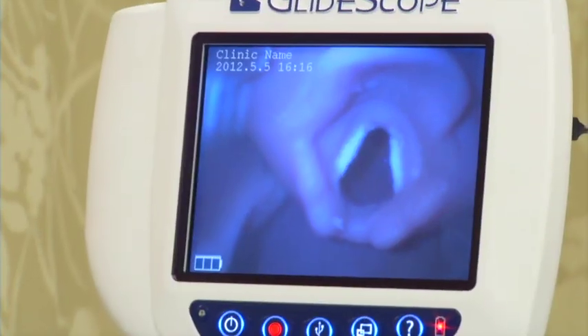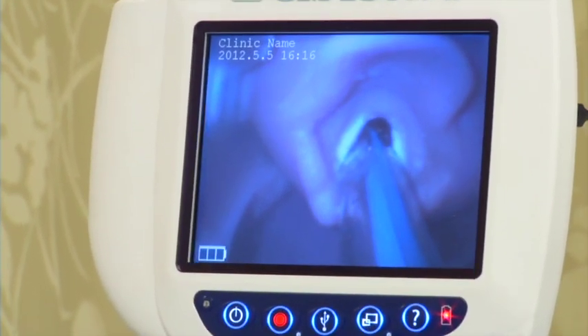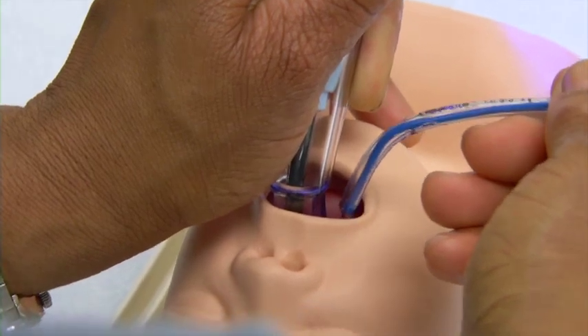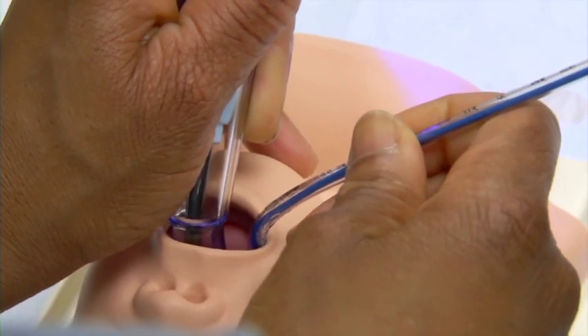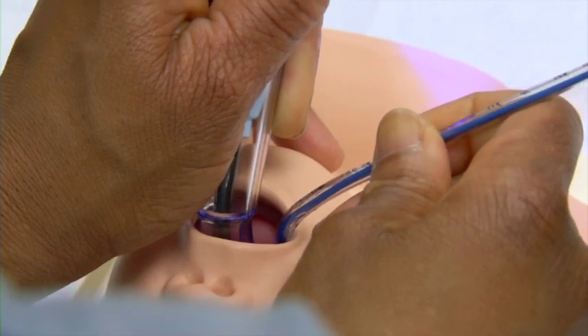At this point, the endotracheal tube should be put adjacent to the blade and then right into the glottic opening. Another tip is to have the endotracheal tube enter from the corner of the mouth, being very careful that you're observing the placement of the endotracheal tube to avoid any trauma to the soft tissue.